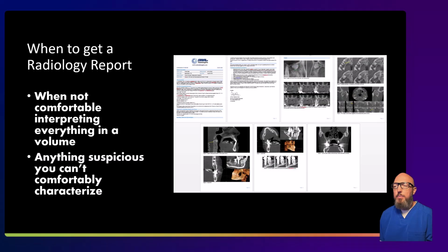And so if you see complex pathology or unusual findings, probably a case where you want to refer. That's what I do for private practice, and there are many other radiologists doing the same thing. Oral radiology private practice is largely driven by CBCT reporting right now. So it's available, it's out there. There's no excuses for missing things anymore.